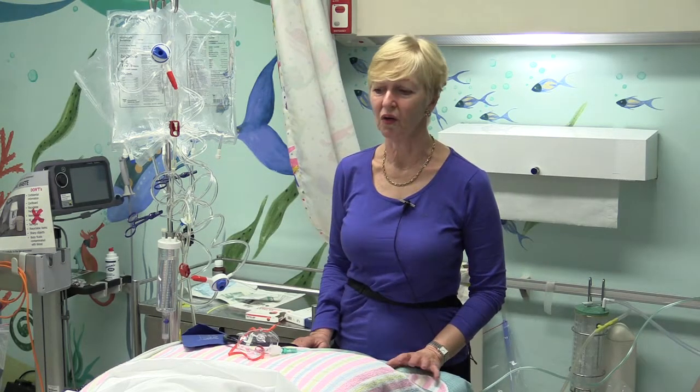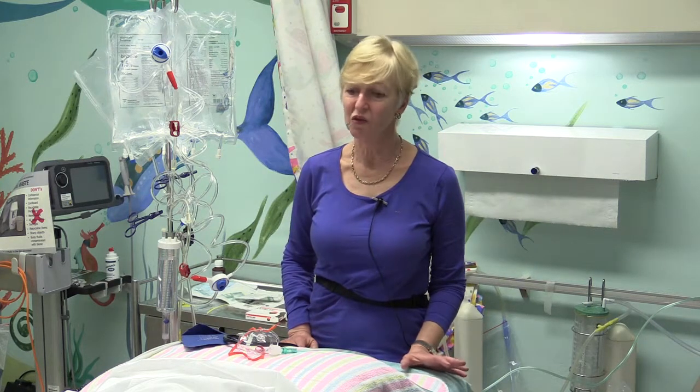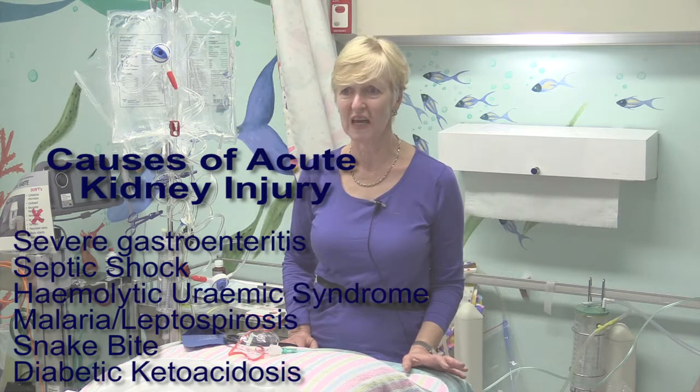This training module is a practical demonstration on the use of acute peritoneal dialysis in children with life-threatening acute kidney injury. The types of situations we envisage that it may be required is where the children are anuric following severe sepsis, such as with malaria, leptospirosis, severe dehydration following gastroenteritis, acute hemolytic uremic syndrome, severe intractable diabetic ketoacidosis or snakebite.